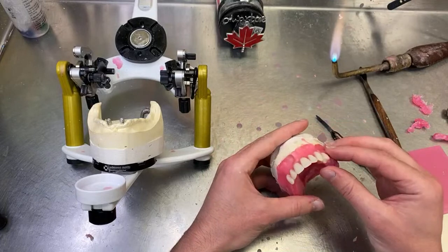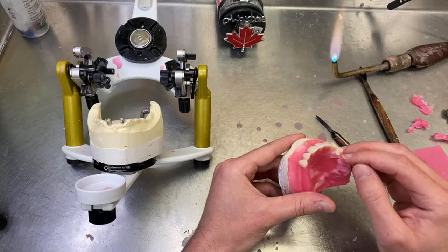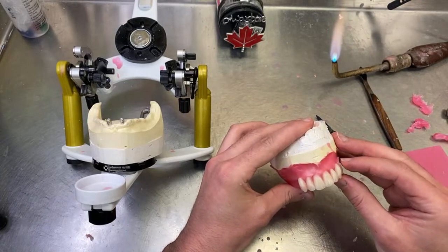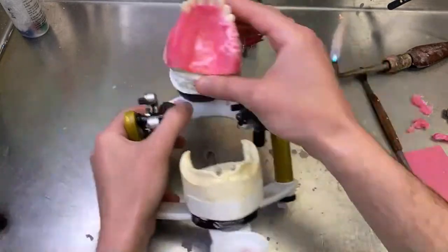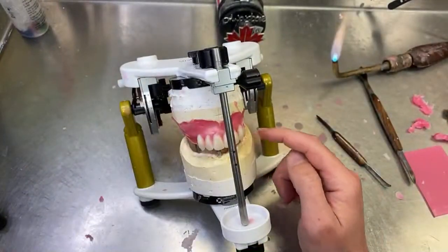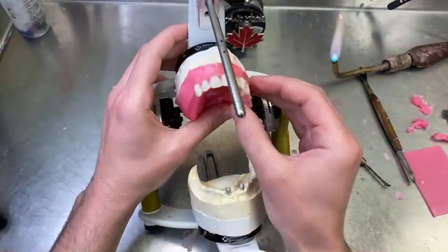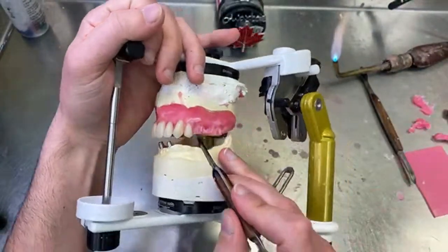Okay, so two things we have to look at here are where the ridge is and how it's going to line up with the lowers. Always keep the lowers in your mind. So now I know it's on top of this. It's not off. It's not going to be too much to the outside. And I need to make it a little straighter.